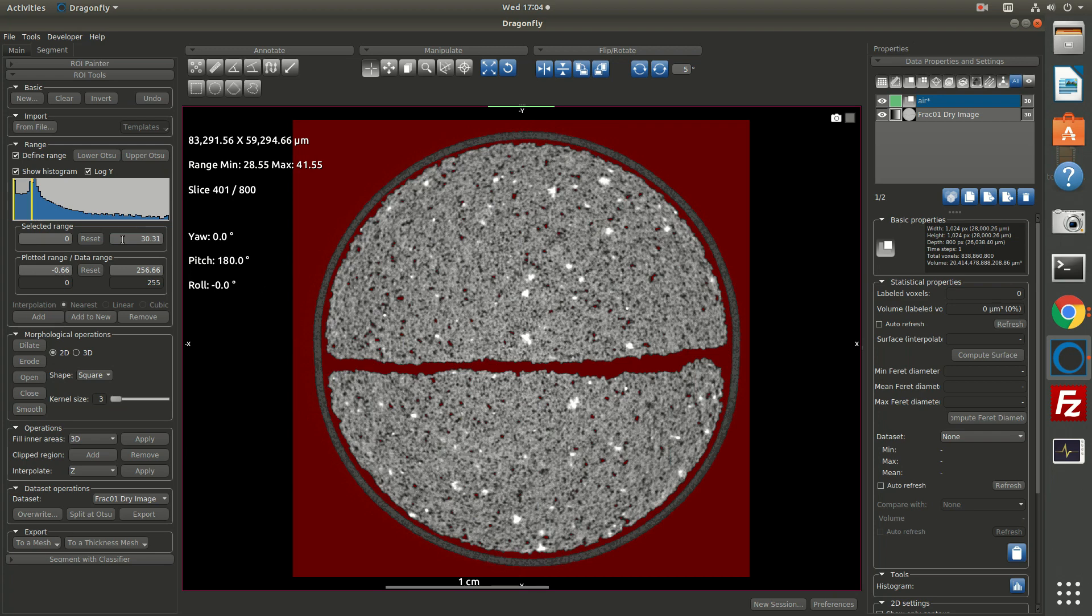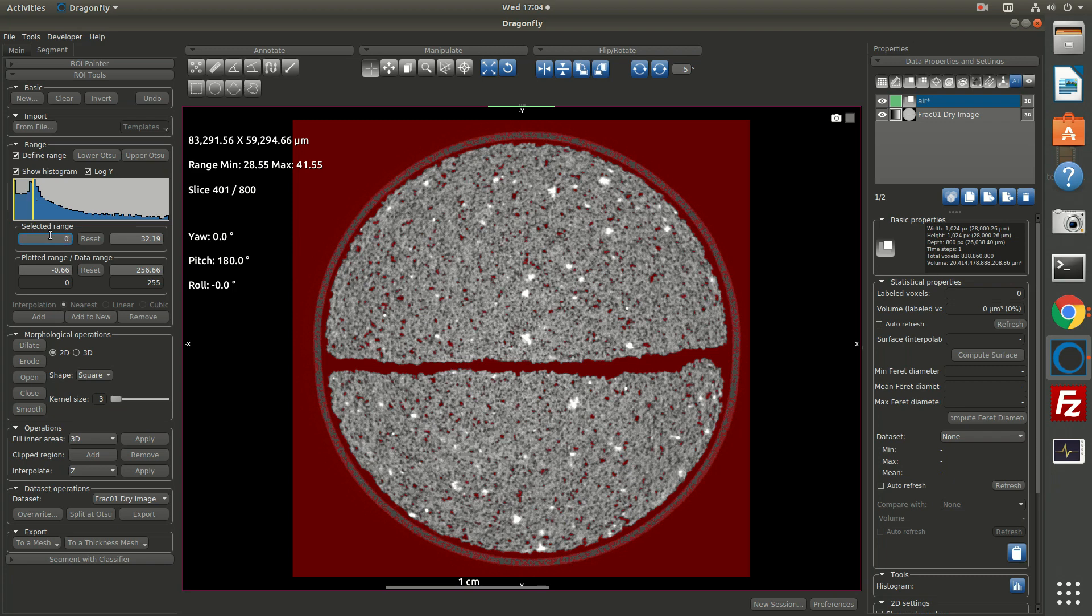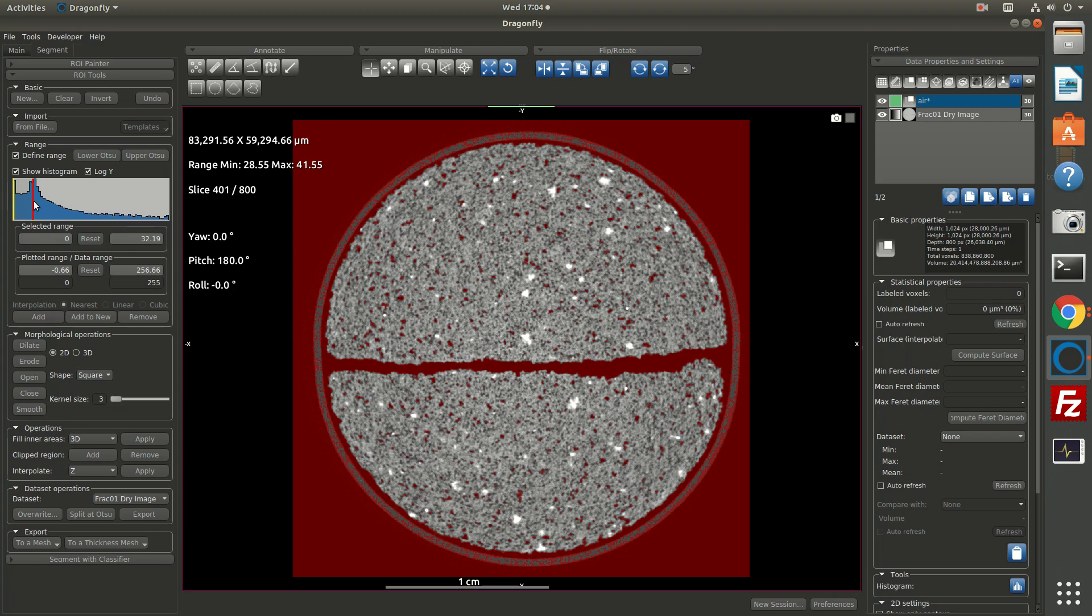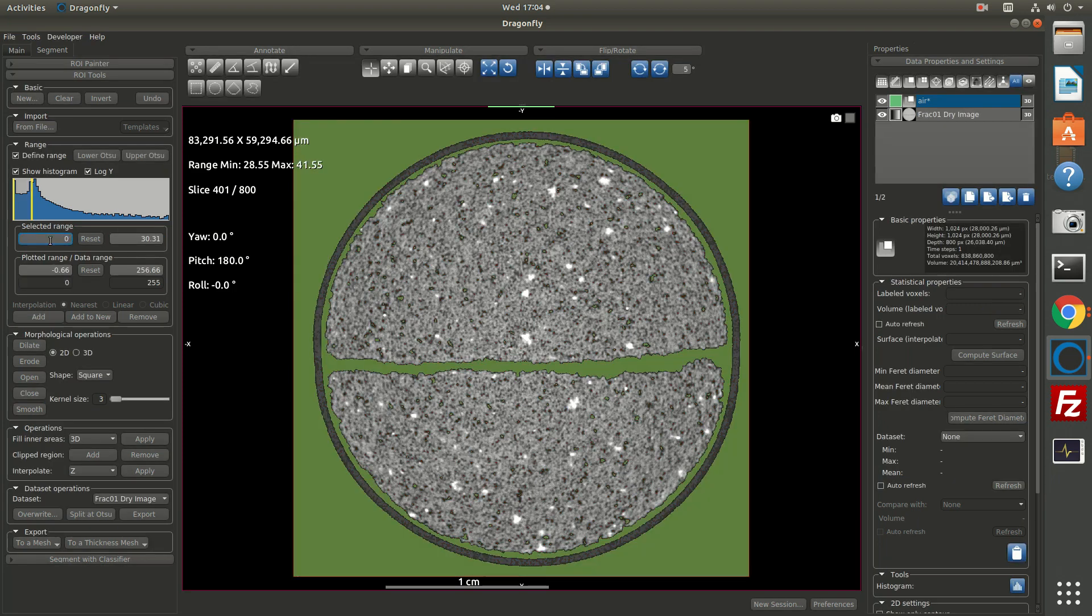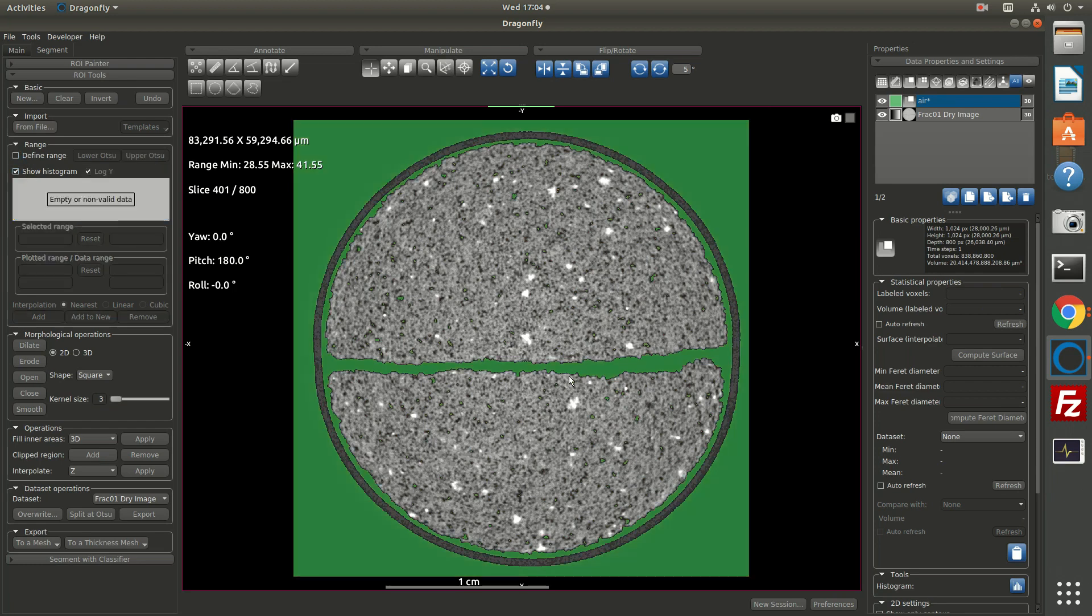And so I want to select the air pixels because I'd like to extract out the fracture. Now I'm also going to see some air pixels inside the pores, inside the porous sandstone, but that's OK for now. So let's suppose I threshold on something like this. And at this point, I go ahead and click add. It's going to add this entire range of pixels, which is currently red. It's going to add it to the air ROI. Let's make it a little more conservative. Now we'll click add. I'm going to turn off define range. And now you see all of these pixels are labeled green.